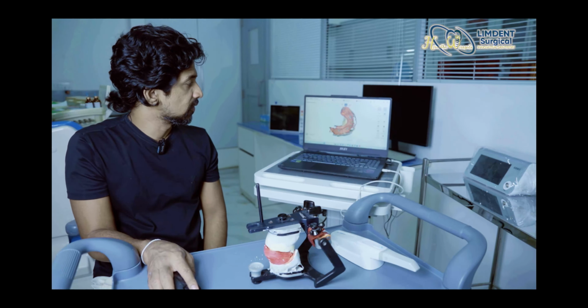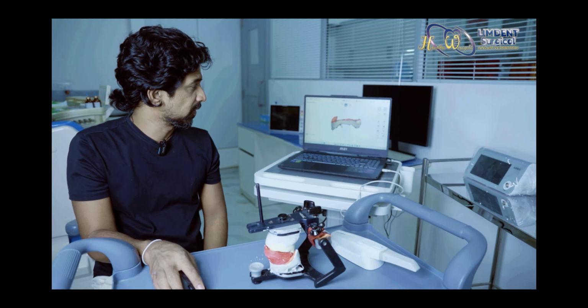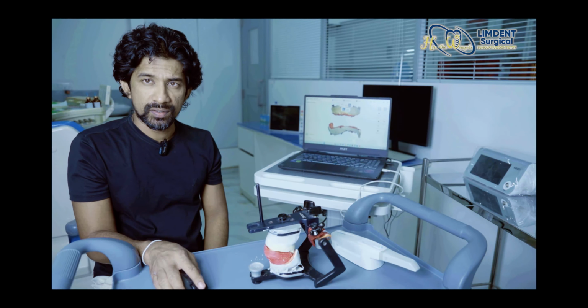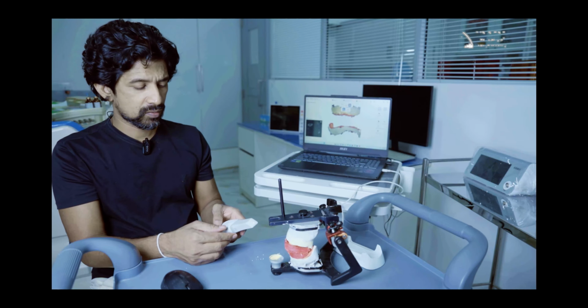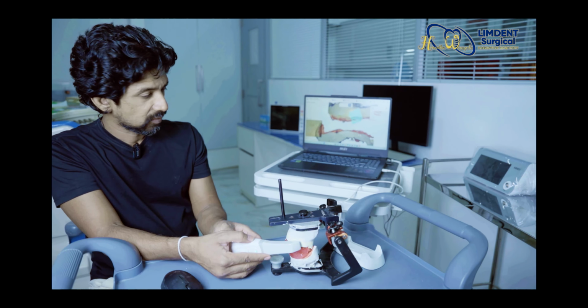In that case, we check for the errors, the modifications, and the requirements of the data that we have collected in the upper and lower, then we can go for the next step, the bite registration collection of data. When you're doing that, we'll keep the articulator in place. When the bite blocks are mounted, then we can start recording the data.